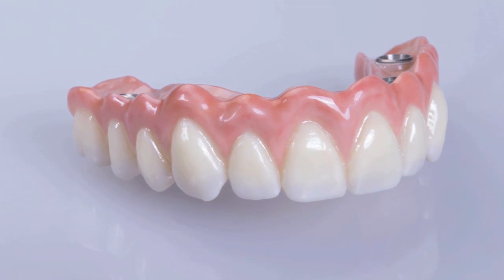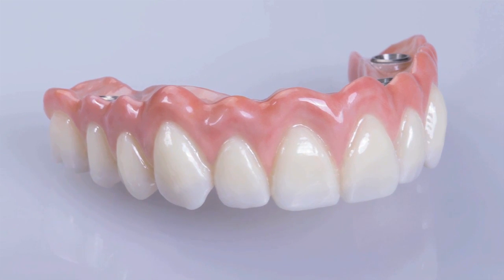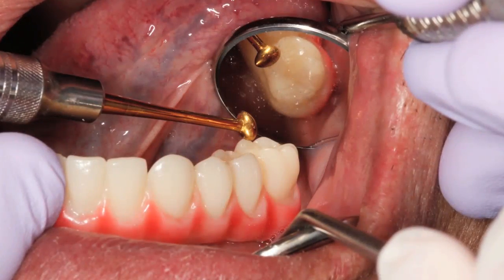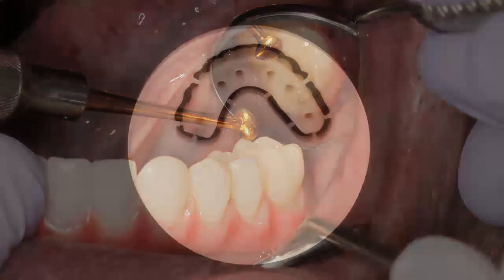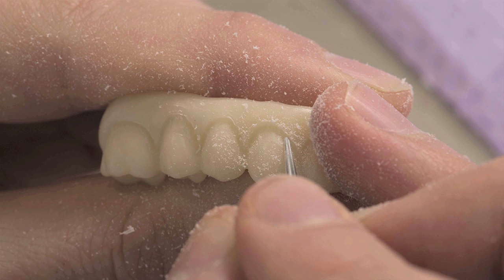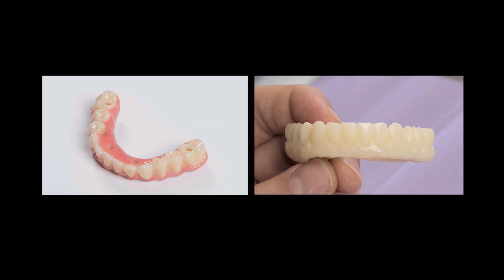Fabricating a full arch prosthesis from Bruxer Solid Zirconia requires significant time, labor, materials, and milling capacity. That is why it is important to verify the fit, occlusion, aesthetics, and functionality of the provisional appliance milled from polymethylmethacrylate, or PMMA. Because the PMMA material can easily be adjusted, it can be scanned and replicated, ensuring that the final prosthesis mirrors the form and function of the temporary appliance.